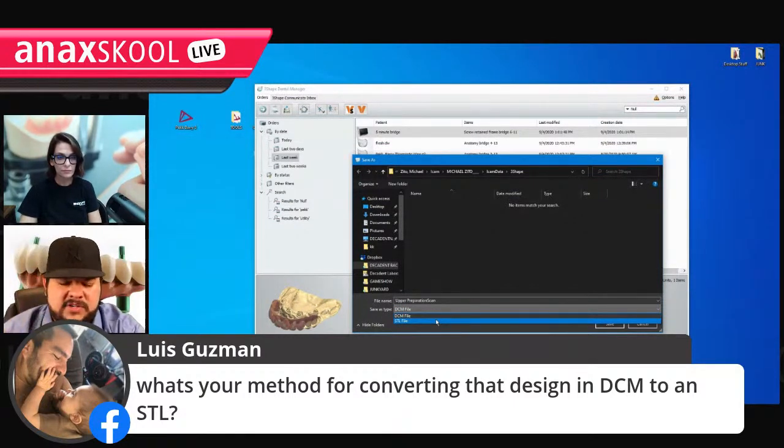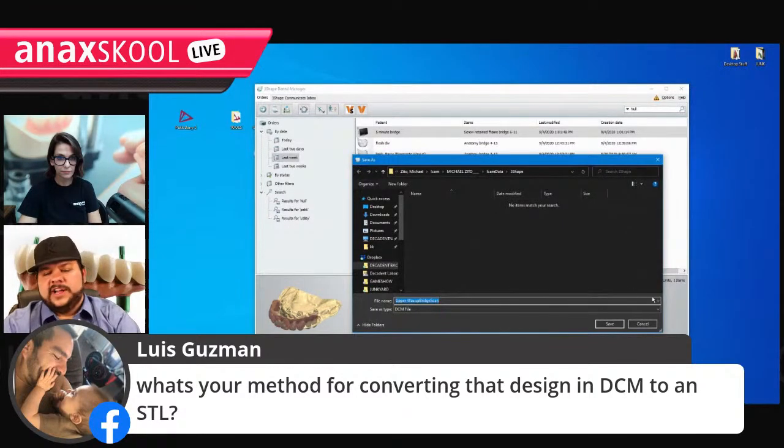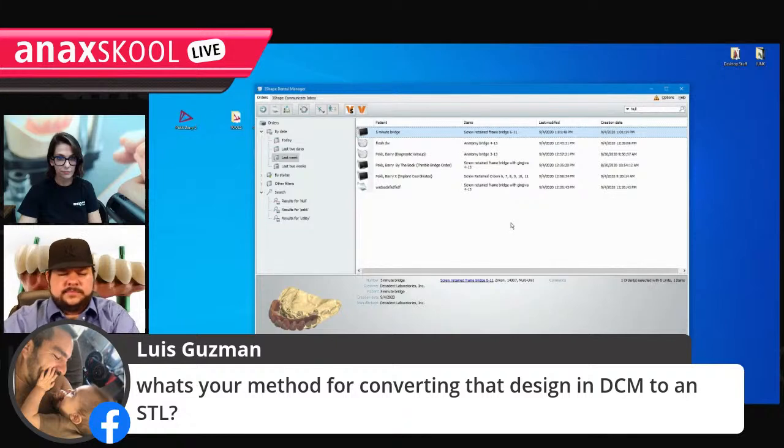If you're curious, just let me know. I'll tell you what else you can use. But then you can grab the STL file and export it, and you're good to go. It'll export both of them. That's it. But if you don't have the license for it, there are other ways. If you don't know how to convert a DCM to an STL by now, you're not ready for this lesson.